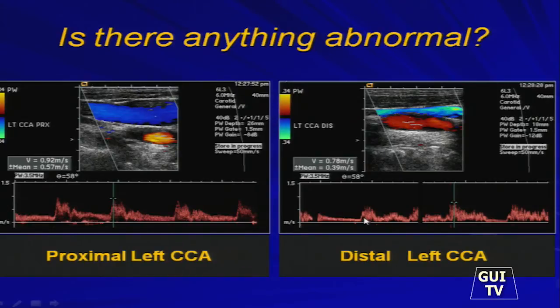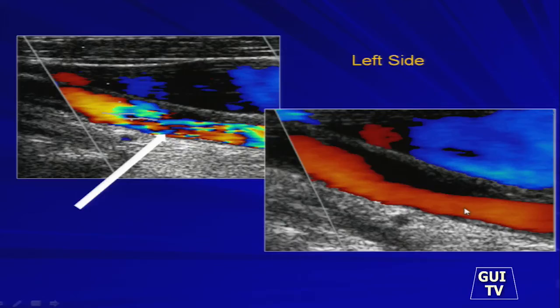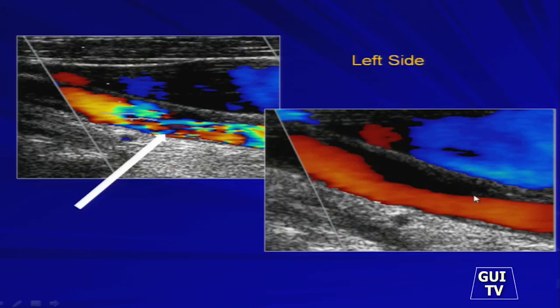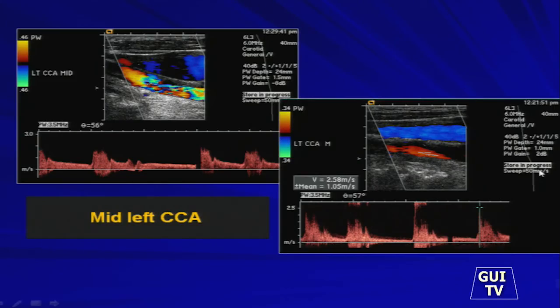What I am seeing is evidence of a delay in upstroke compared to the proximal site. The reason for that is the stenosis that lies between our proximal sample site and our distal sample site. We've got luminal reduction, alias signal, and stenosis there — that's causing the problem. Here's our stenosis and our disordered flow.